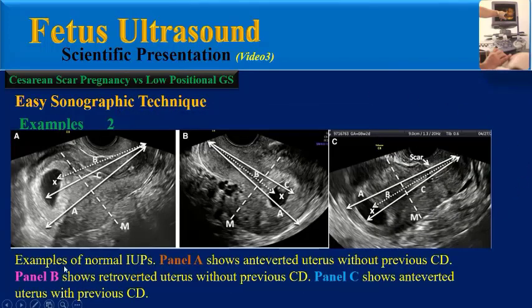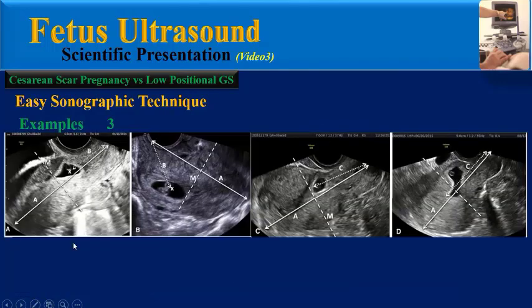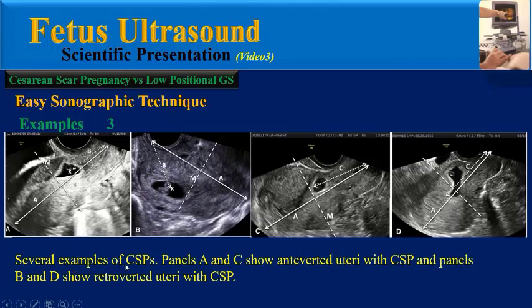In this image, we can see examples of normal intrauterine products. Panel A shows an anteverted uterus without previous caesarean delivery. Panel B shows a retroverted uterus without previous caesarean delivery. Panel C shows an anteverted uterus with previous caesarean delivery. In this next image, we can see several examples of caesarean scar pregnancies. Panels A and C show anteverted uterus with CSP. As we can see in all of these images, the gestational sac is located proximal relative to the M line.